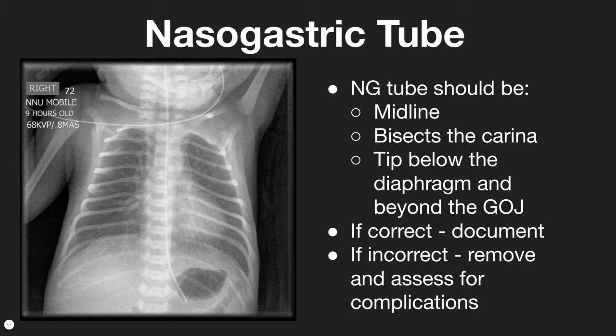If the tube is incorrect, then let the patient's nurse know that it is not safe for use and contact a relevant senior.